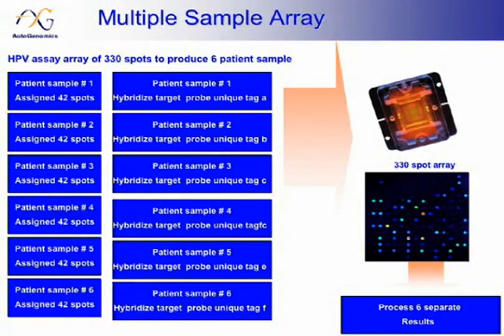So the first thing was, how can we use a microarray where we can take multiple patients, as many as 10 or 15 patients, without getting any crosstalk or cross information, and be able to put all those DNA on the same chip and find its assigned spot.